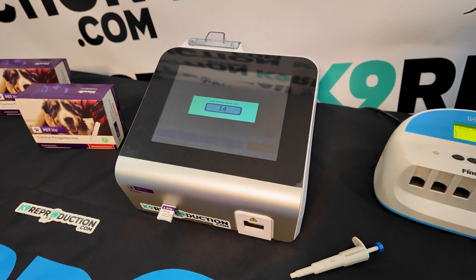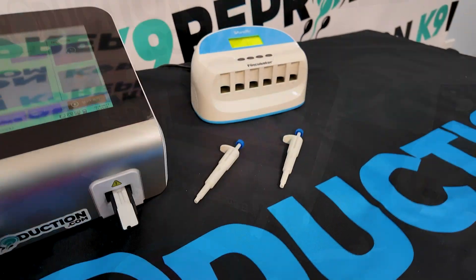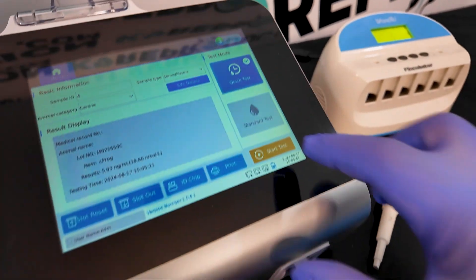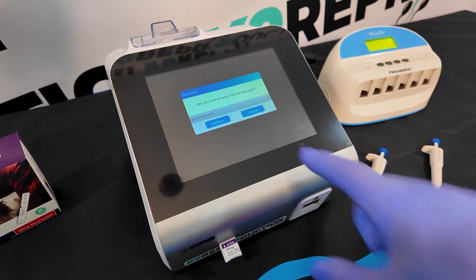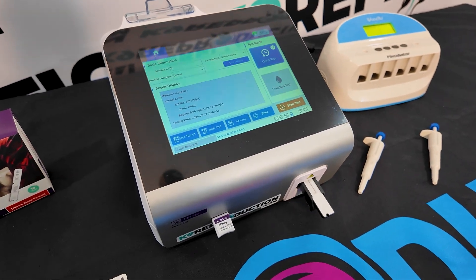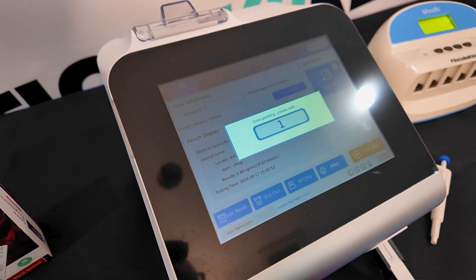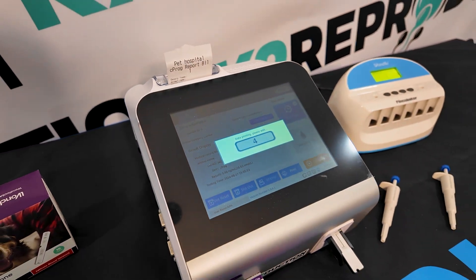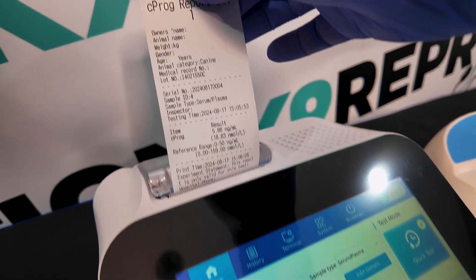The Wanfo Pro-DX machine also offers a standard test option. In this mode, you insert the strip directly into the machine without using the FinCubator, and the machine will automatically set a timer for the incubation period. However, this should be used as a last resort when you're out in the field, as the Wanfo Pro-DX does not have built-in heaters and cannot guarantee the strip is incubated at the necessary 78 degrees, which may lead to inaccurate results.